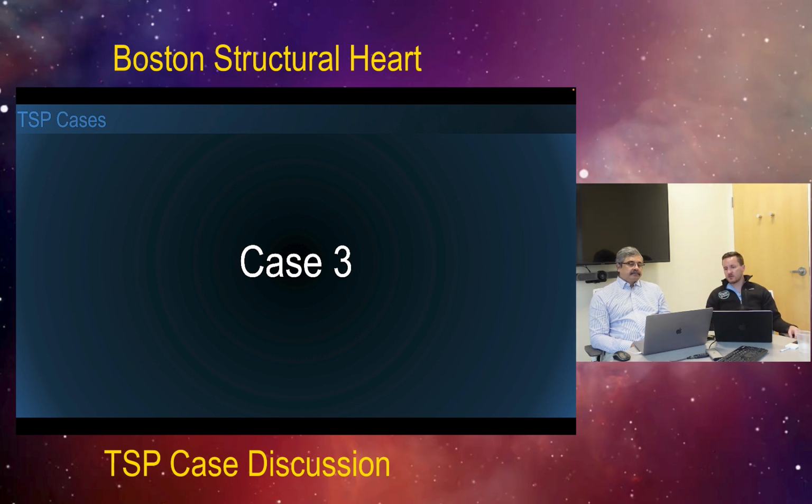But second of all, I think to me the most important thing is that if you are not achieving the optimal imaging or seeing the transseptal needle in your initial images, there's nothing wrong with doing a reboot, starting again, putting the needle back into the SVC, and starting the PITLOC protocol from the very start, rather than trying to keep finding this needle somewhere in the vicinity of the fossa ovalis. Just take a reboot, start again, and just very slowly, in constant communication with the proceduralist, track that needle as it's coming down onto the fossa.